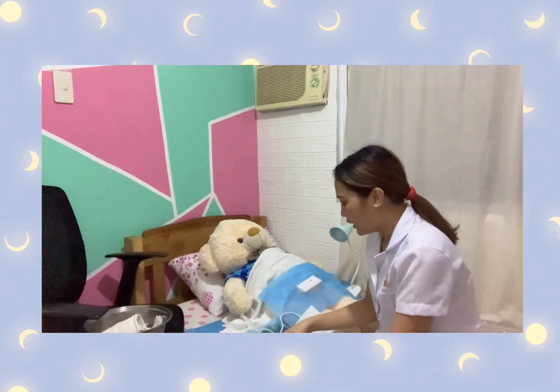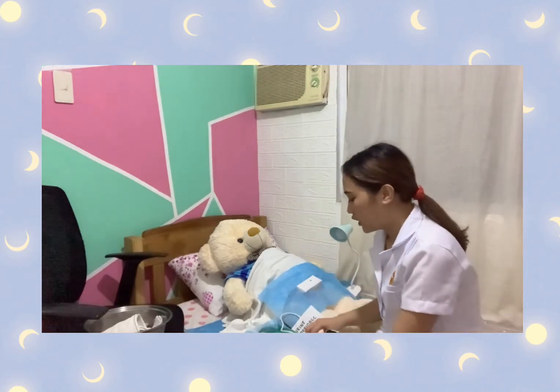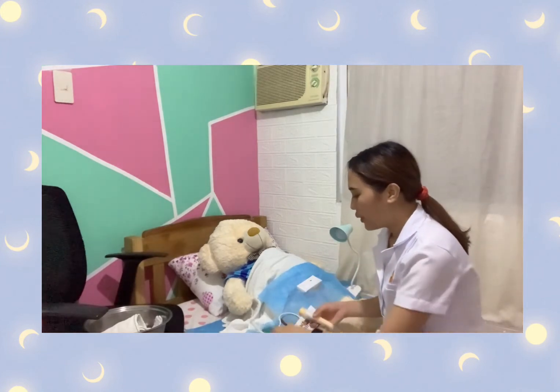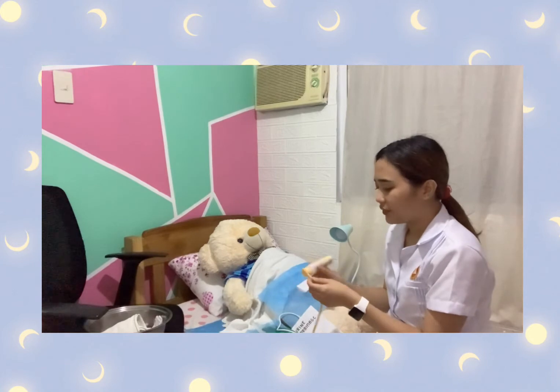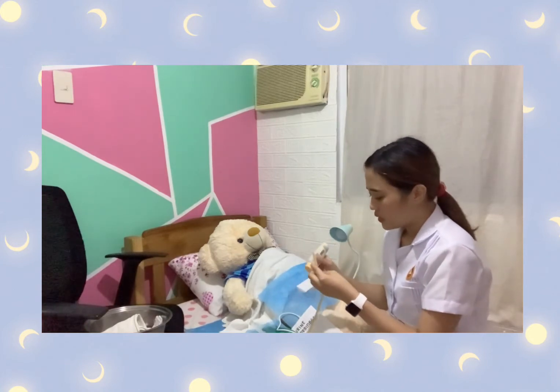After that, we can now open the specimen container if there are specimens to be removed from the container. After that, we will lubricate the tip of the catheter.